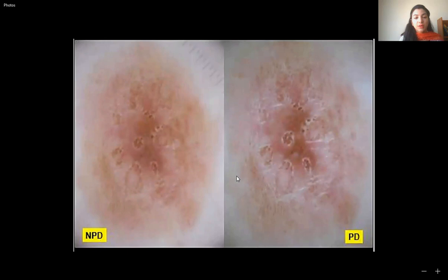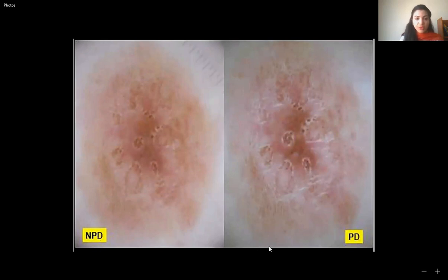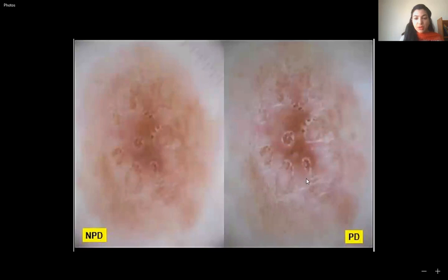As seen in the second image, the short white lines or crystalline structures are visible more with polarized dermoscopy and not with non-polarized dermoscopy. This lesion belongs to BCC, and the typical feature of short white lines is obviously more prominent with the polarized dermoscope.